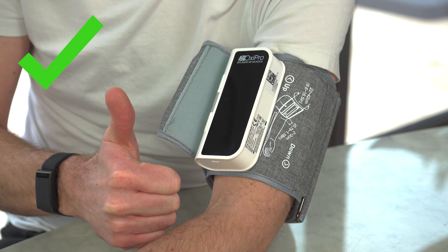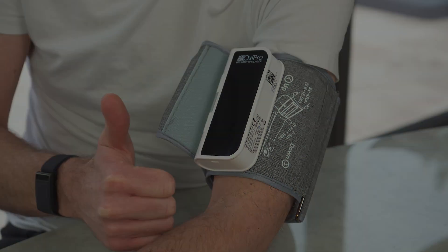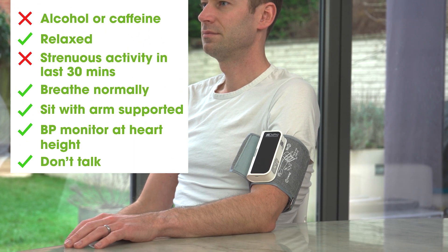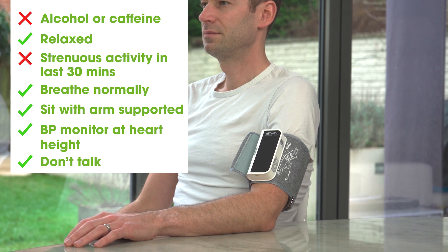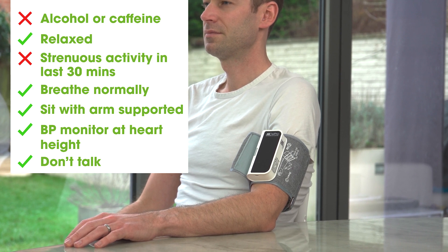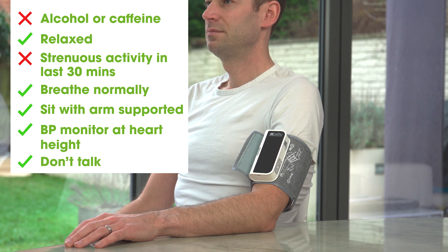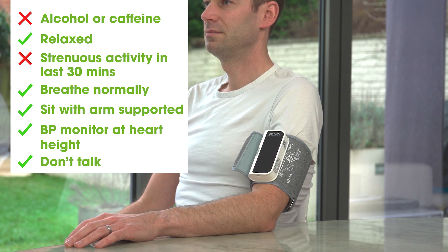Consistent positioning and tightness of the cuff will give you consistent results. When ready to test, make sure you are not under the influence of alcohol or caffeine, as this will temporarily affect your blood pressure. Make sure you are relaxed, have not done any strenuous activity in the last 30 minutes, and are breathing at your normal rate and not feeling stressed.